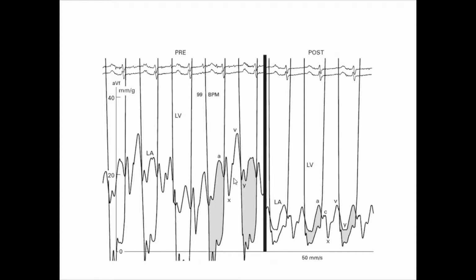Yes. What happened post procedure? So this is most likely balloon valvuloplasty, commissurotomy. Yeah, describe your right hand. So on the right hand, this is a hemodynamic tracing, simultaneous hemodynamic tracing between LV and LA. Good. The scale is not visible to me, but it is the same scale, 0 to 40. The same scale. And there is significant reduction in the diastolic gradient between LV and LA. Good. During diastole, there is a significant reduction in the diastolic gradient between LV and LA.